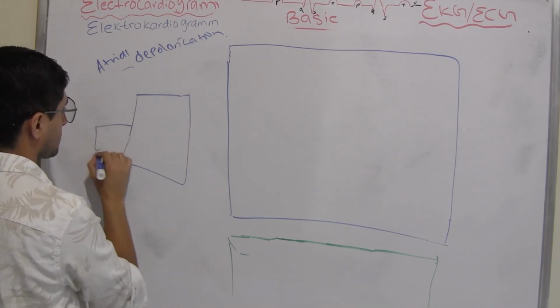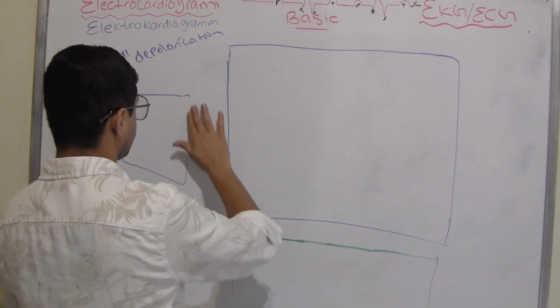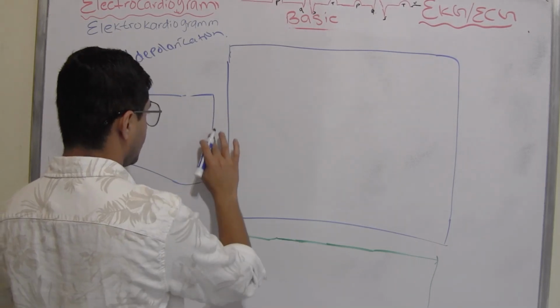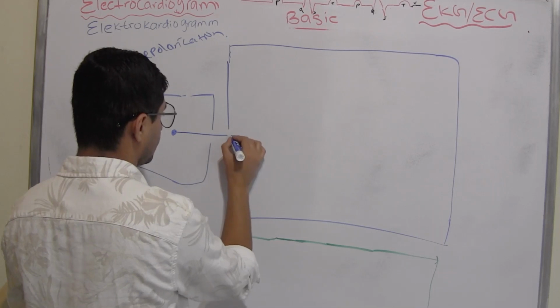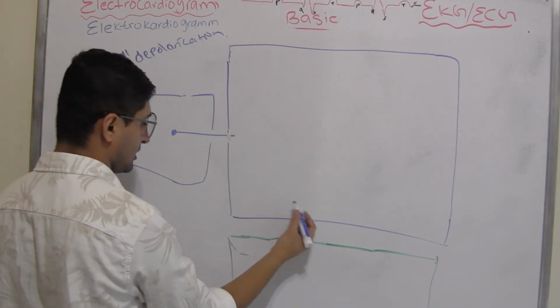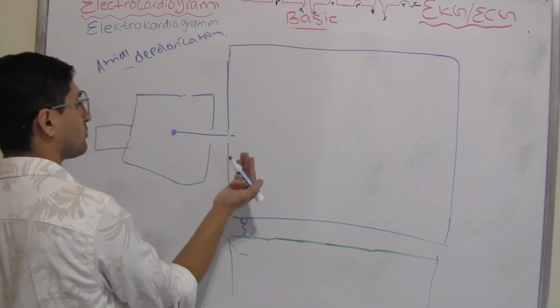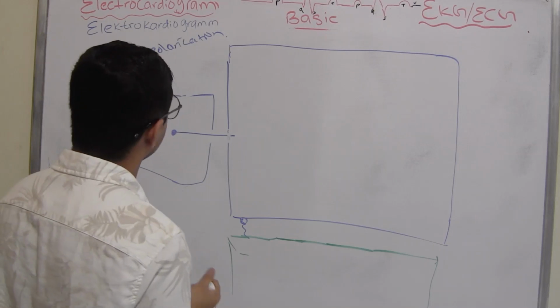And obviously, it's going to read. And let me draw a needle here. The needle's right here, okay? Let's say I put a motor here. This is a motor, okay? And the paper will roll in this direction, and then this needle will read it and draw the ECG line.